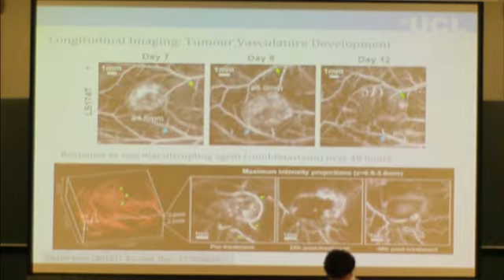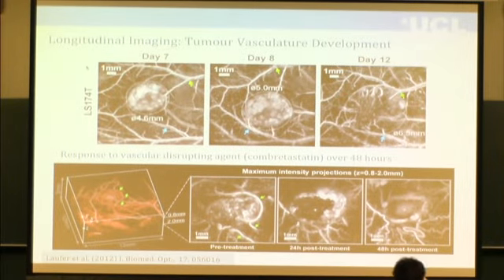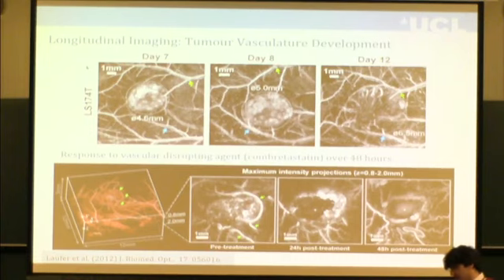Simon showed an image earlier. Here are some other images that we get. These are images being used by people doing cancer research to look at how certain drugs disrupt vascular growth during cancer. But you can see these vessels quite nicely formed. And I've got one more.